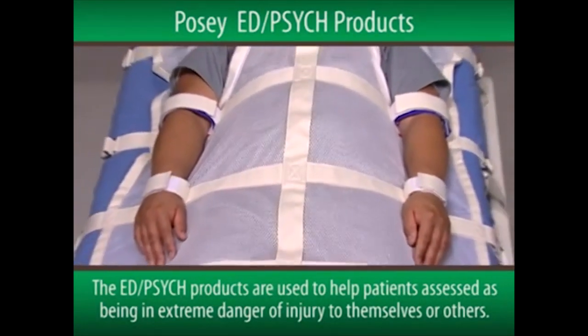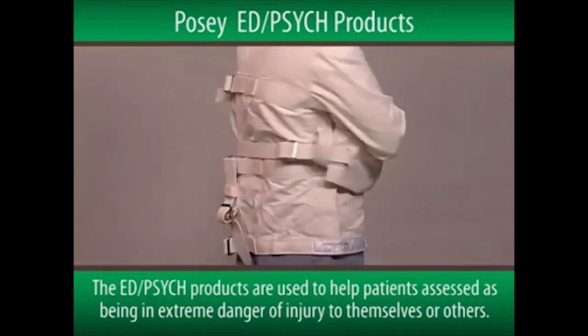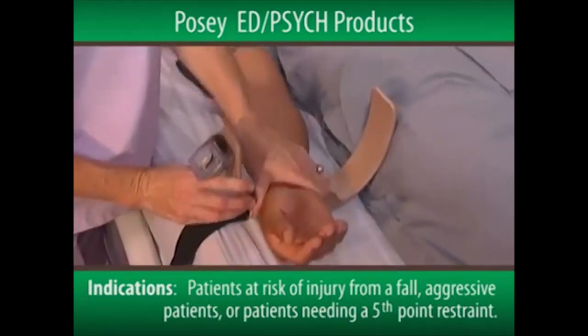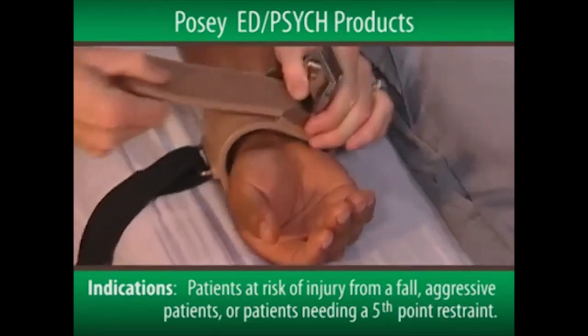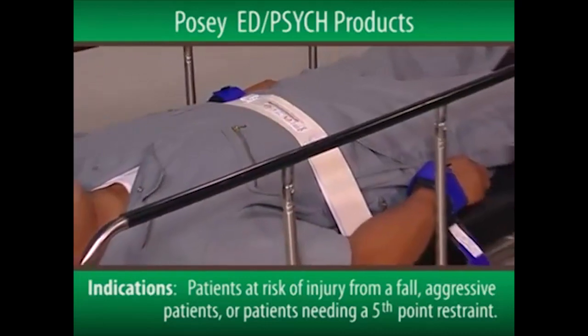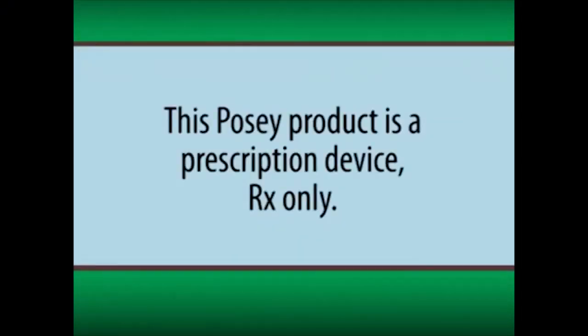The Posey ED Psych products are used to help patients assessed as being in extreme danger of injury to themselves or to others. Indications are for patients assessed to be at risk of injury from a fall, patients who are aggressive and attempt to buck up and down, risking potential self-injury or disruption of treatment, or patients who need a supplemental fifth-point restraint of the thighs, pelvis, or chest, and are already restrained at all four extremities. It's important to note that this Posey product is a prescription device, RX only.